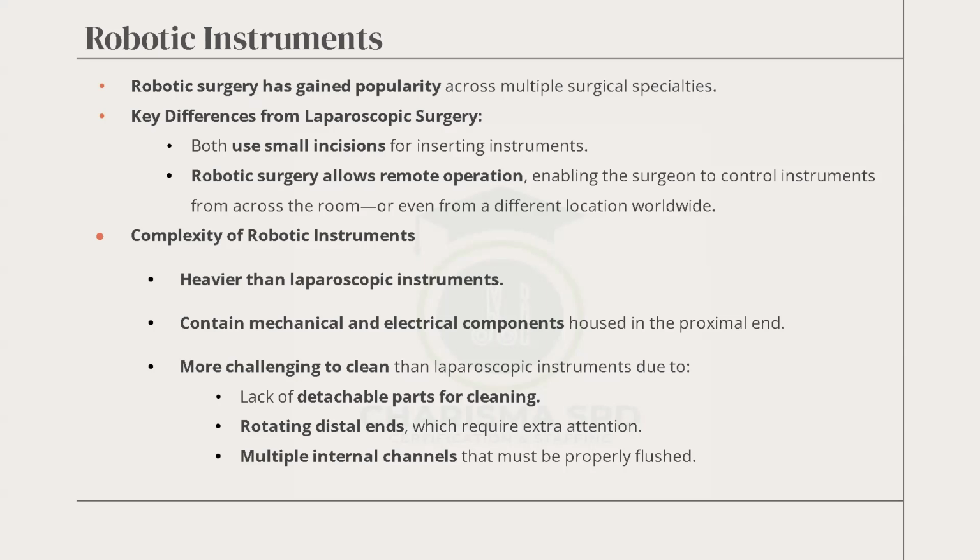I think every robotic arm has 2 ports, if I'm not mistaken. I've not seen one that has 1 port. So you have to flush both ports, both channels.